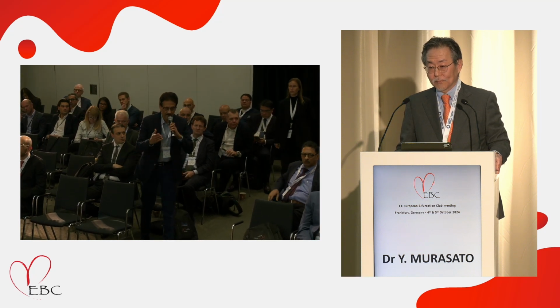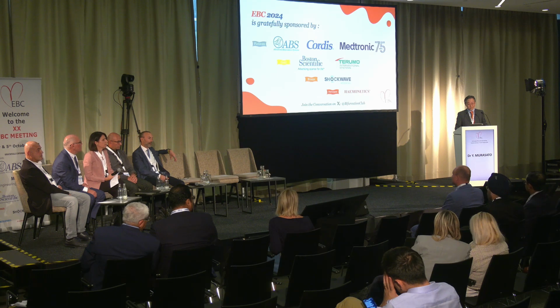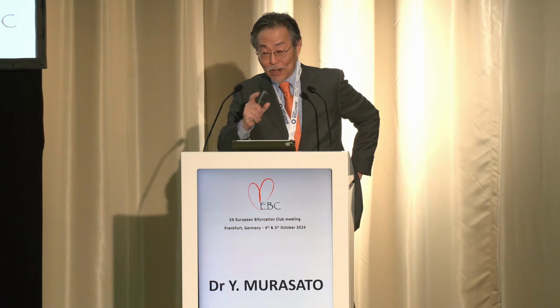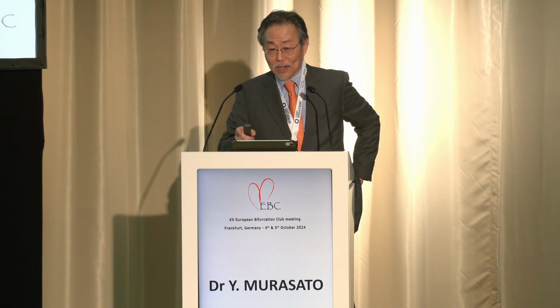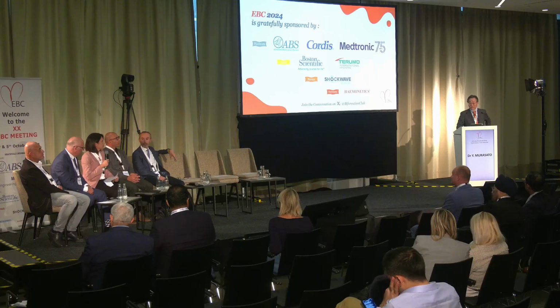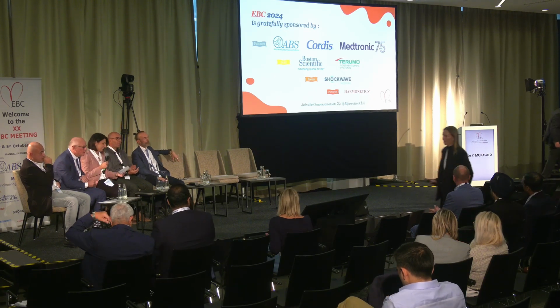Yes. Also, there is the risk of 2 stents in the left main. There is also another risk. However, reduction of the atheroma plaque volume is very important, and DCA is the only device for atheroma plaque reduction. So thank you very much. Sorry, for the sake of time.